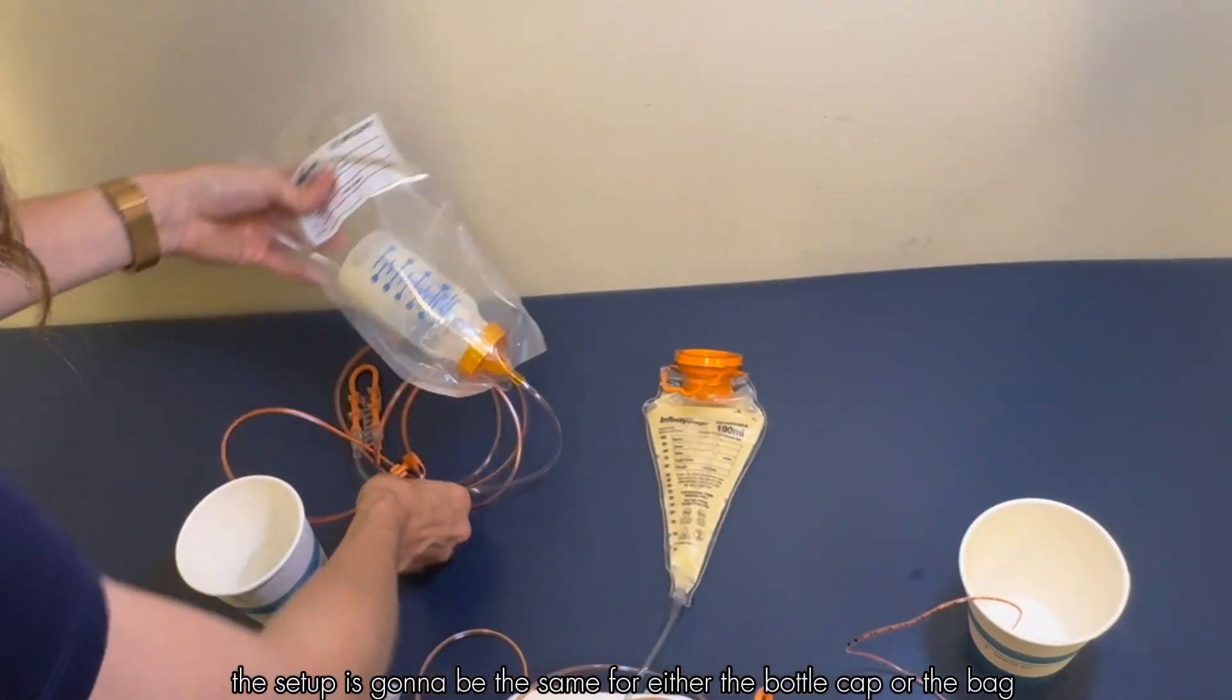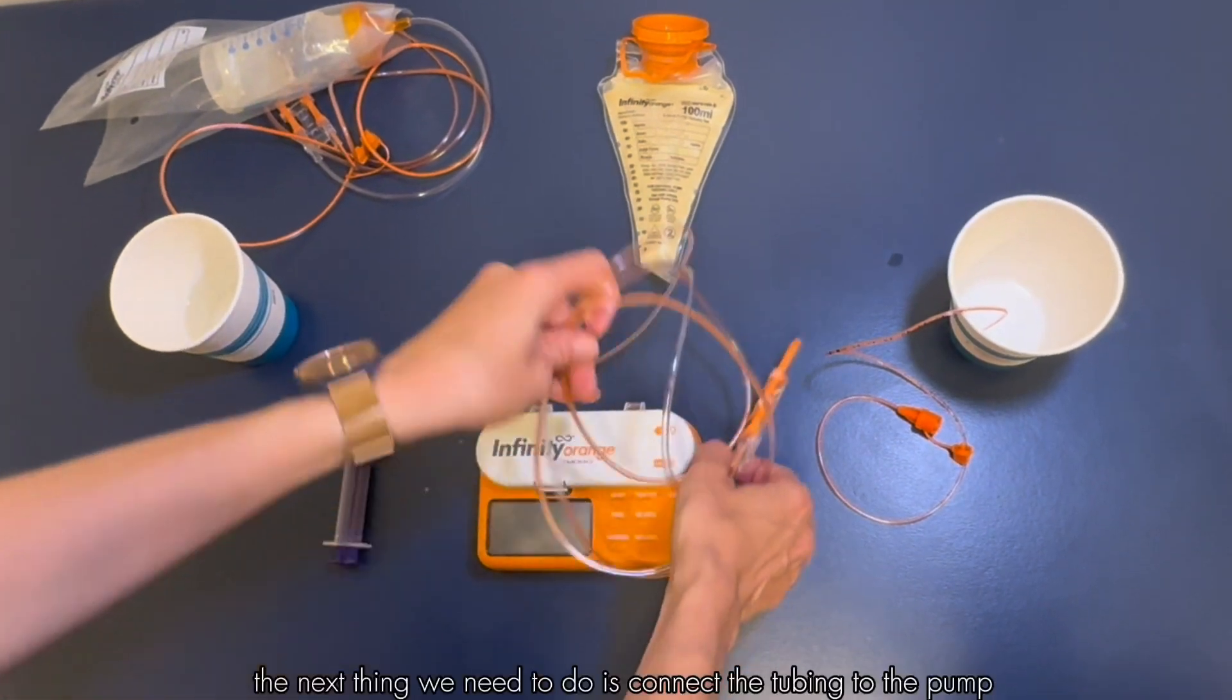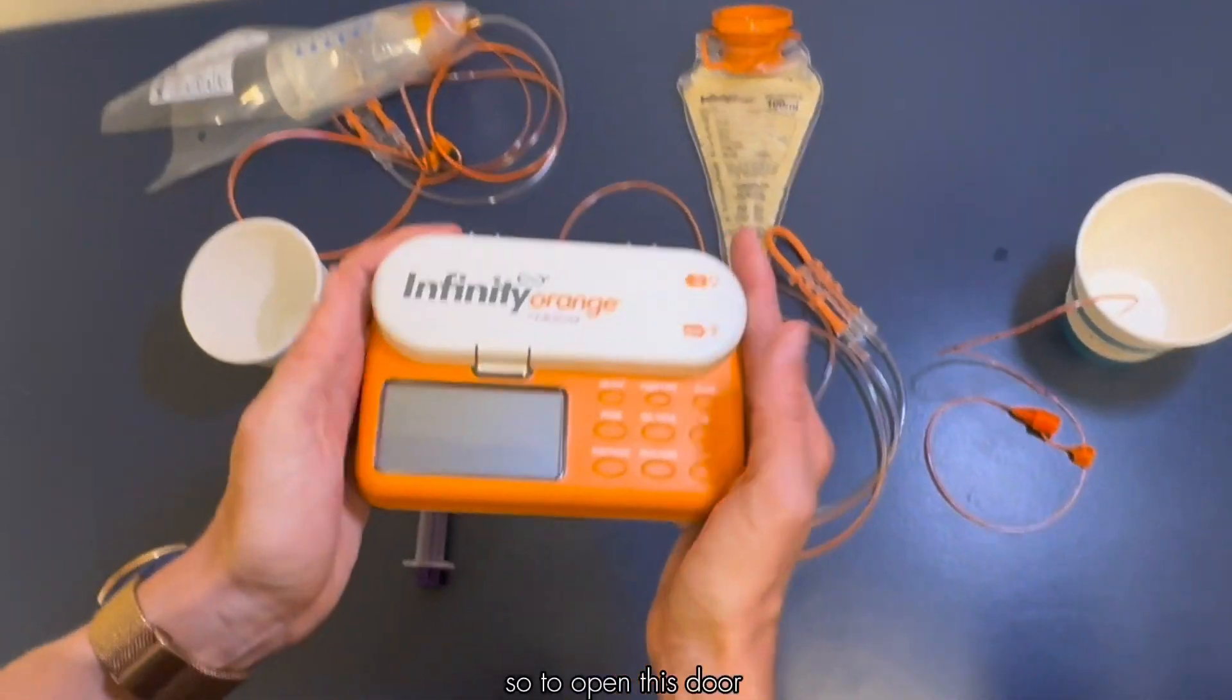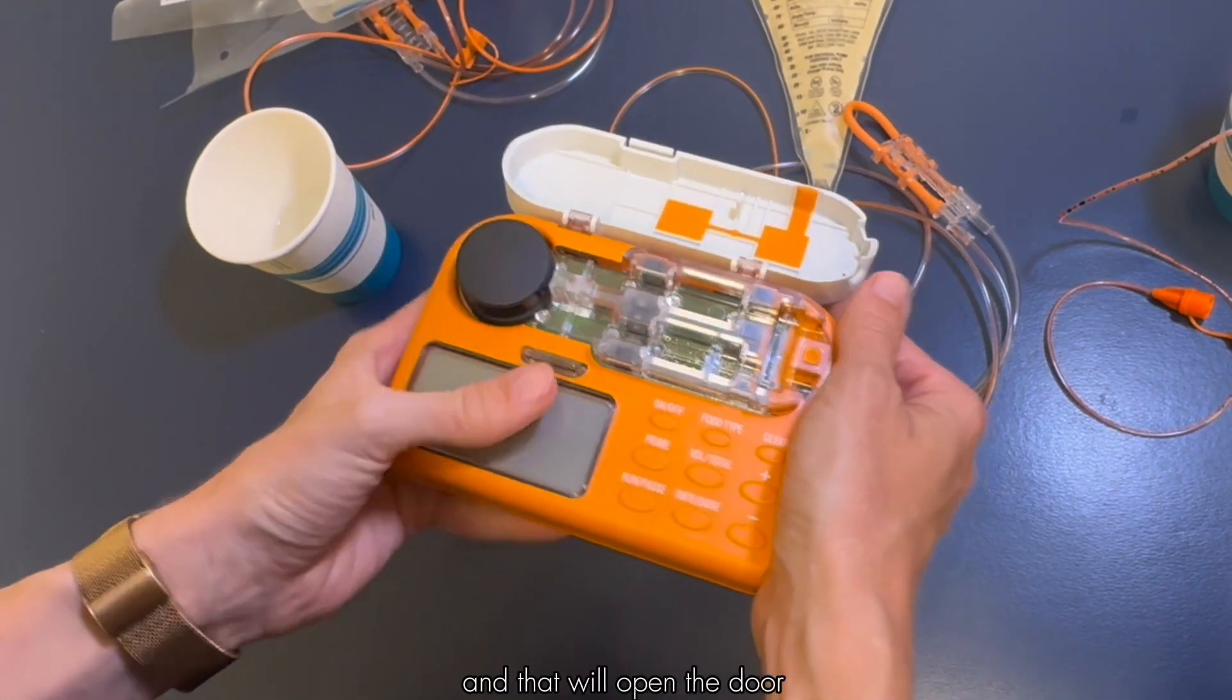From here on the setup is going to be the same for either the bottle cap or the bag. The next thing we need to do is connect the tubing to the pump. To open this door I like to take a thumb on either side and push in and up and that will open the door.